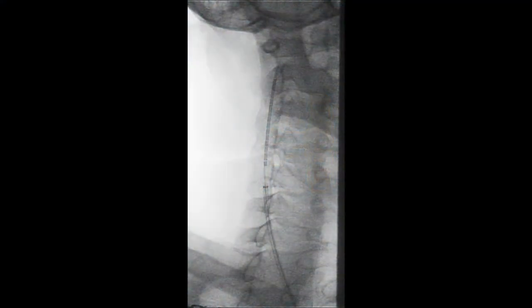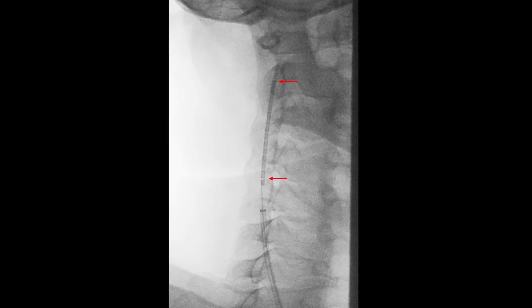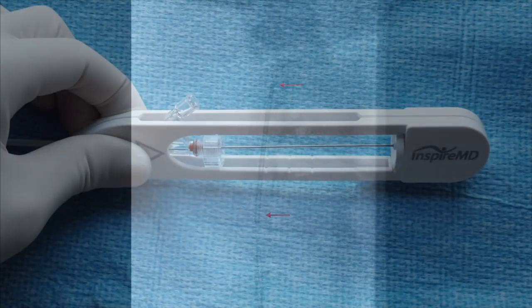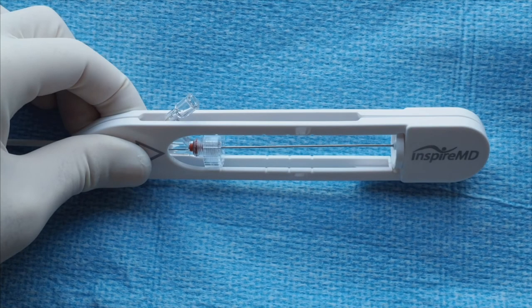Ensure optimal positioning of the stent prior to deployment. After verifying stent positioning, keep the handle system in a fixed position avoiding displacement.